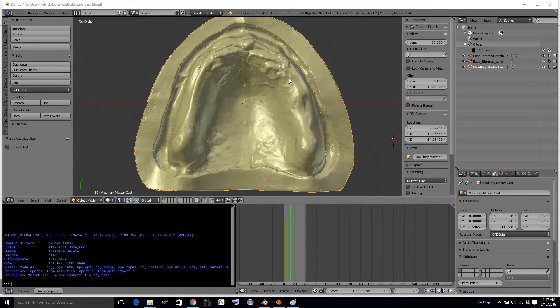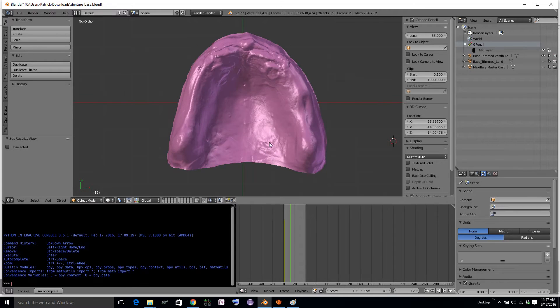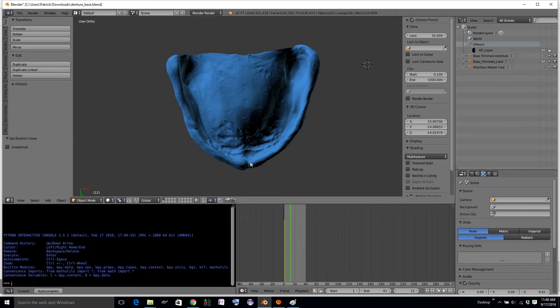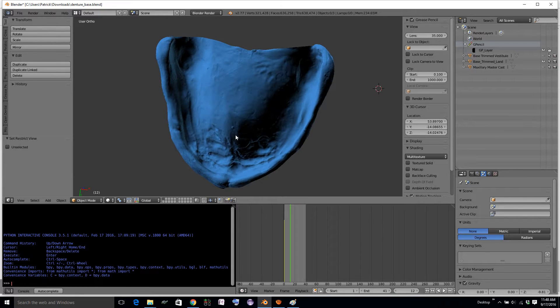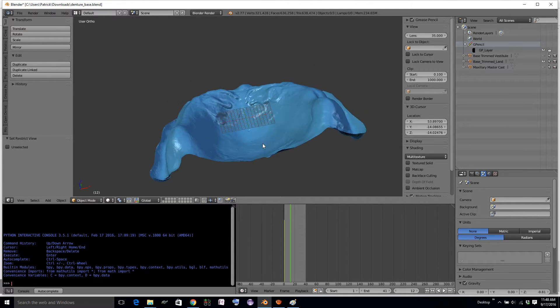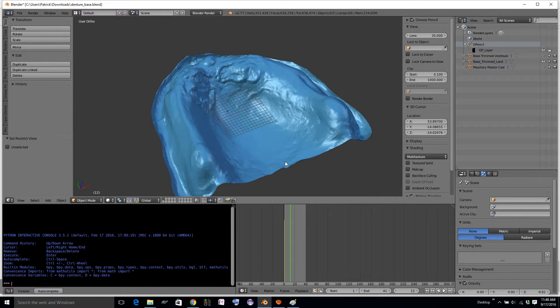Here we have a master cast for a complete denture, and what we might want to do is trim out just this part, which I've done using the poly trim previously. In this case I've trimmed it at the length of the cast. So this is what we'd like the intaglio surface of our denture to look like, or of our custom tray, plus or minus a little offset.